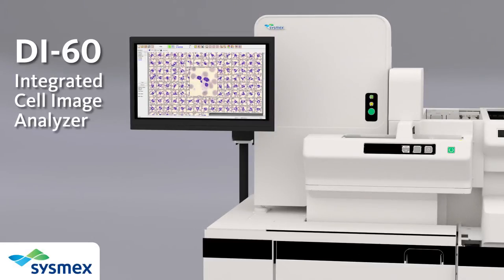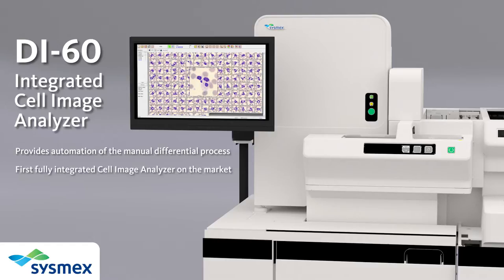Introducing the Sysmex DI60 Integrated Cell Image Analyzer. The DI60 is the first fully integrated cell image analyzer on the market, allowing a single sample placed on the system to produce CBC results, smear preparation, and digital cell location and pre-classification.